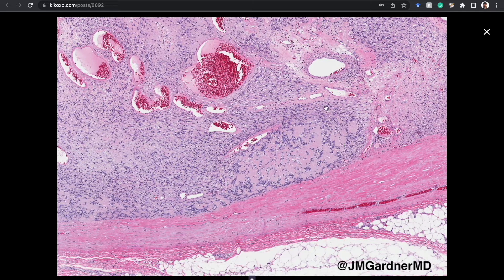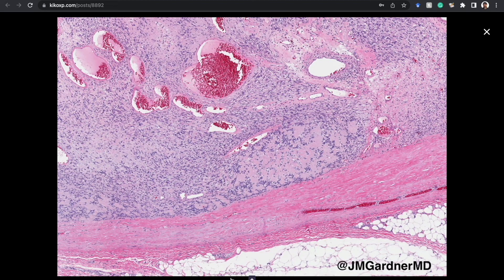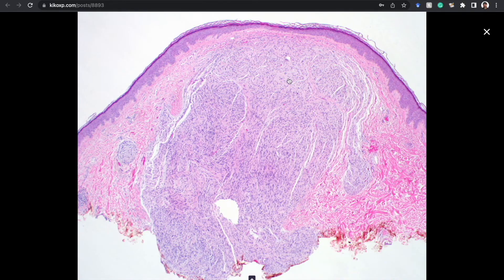Now briefly: palisaded encapsulated neuroma, also called solitary circumscribed neuroma. Despite the name, it's not usually beautifully encapsulated — it is often circumscribed, but doesn't usually have a thick capsule like schwannoma. It's usually centered in the dermis.